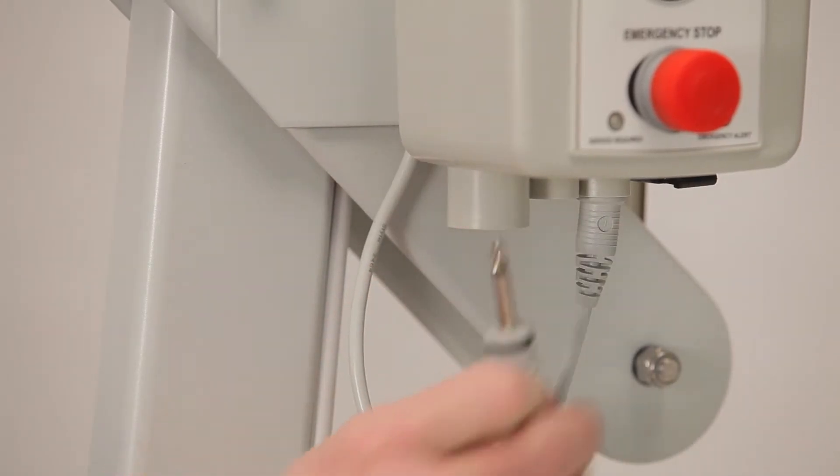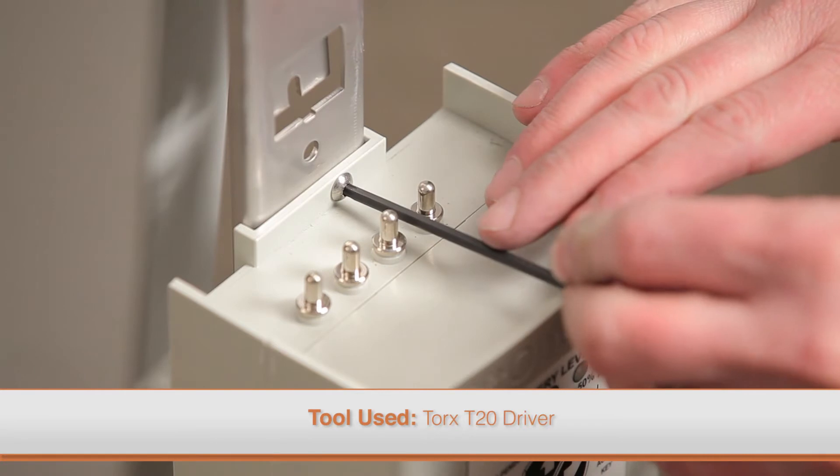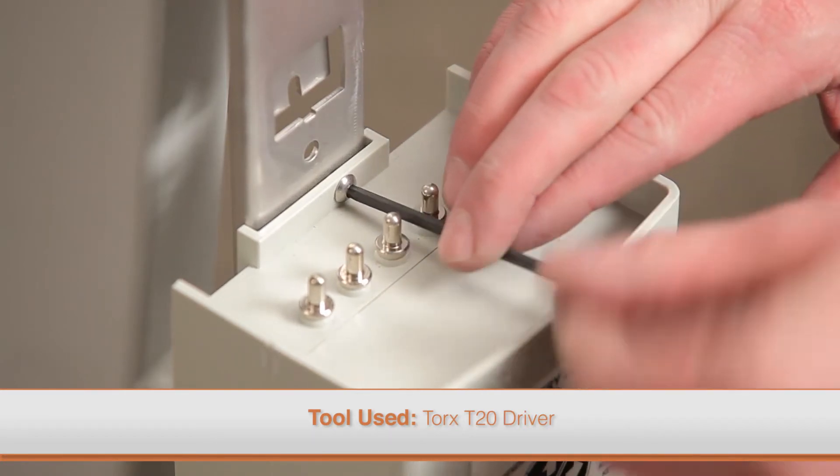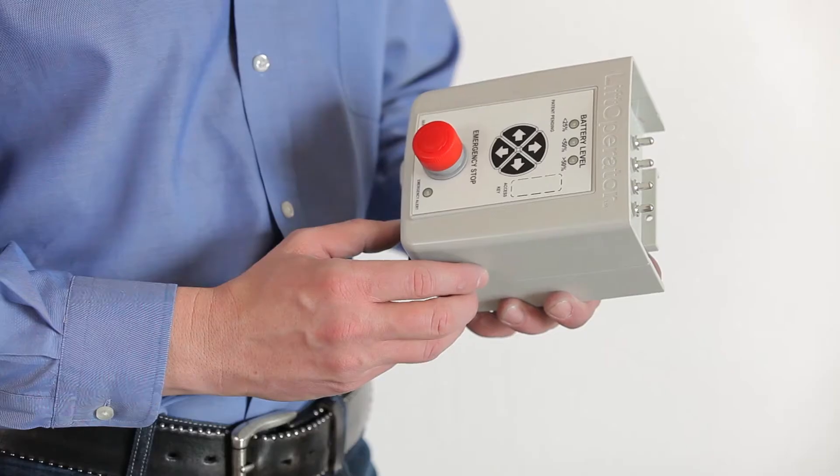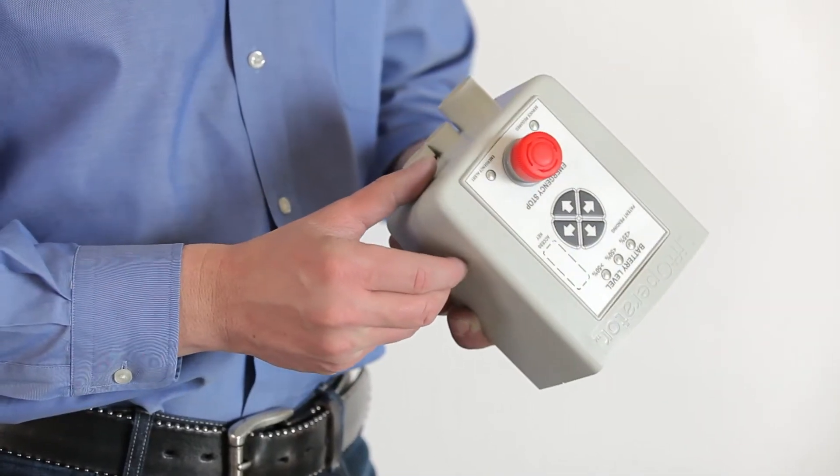To replace the control box, remove the battery, then all of the cables. Remove the Torx screw on the top of the control box using the appropriate driver.